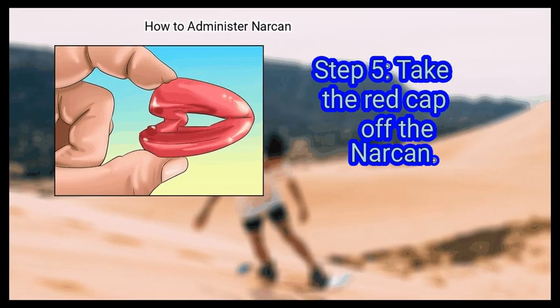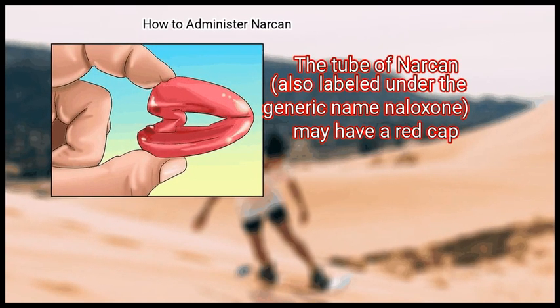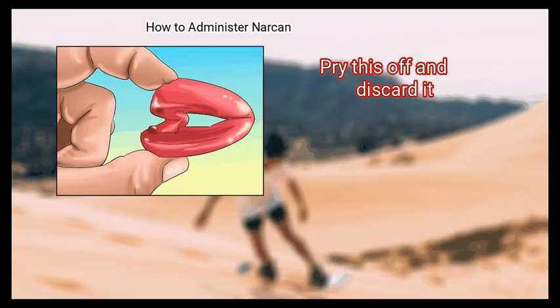Step 5. Take the red cap off the Narcan. The tube of Narcan, also labeled under the generic name naloxone, may have a red cap. Pry this off and discard it.